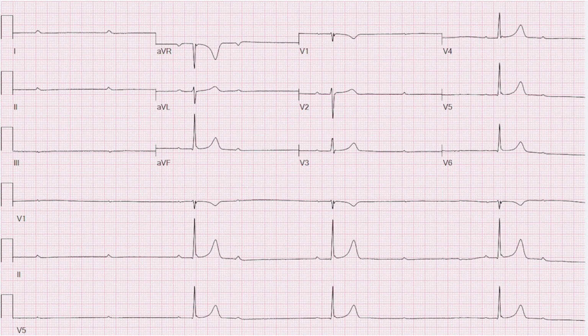A. Type 2 Mobitz heart block, B. Wenckebach heart block below the bundle of His, C. Complete heart block above the bundle of His, D. Complete heart block at the bundle of His, or complete heart block below the bundle of His.